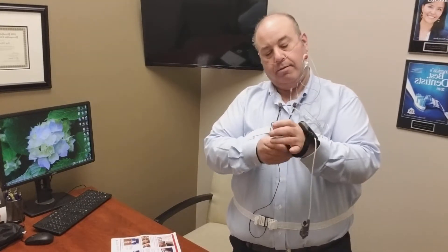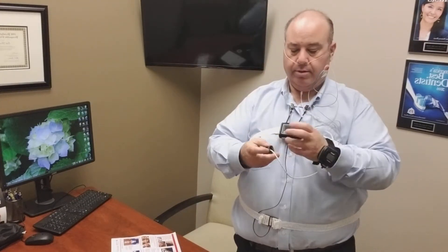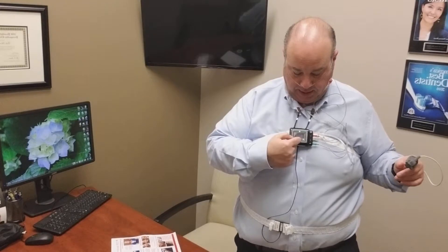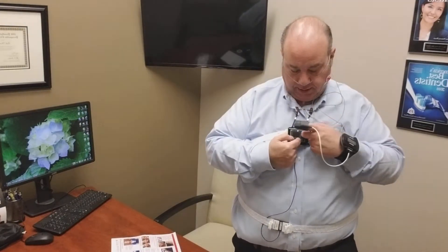Next, the pulse oximeter. This will go on your wrist, and you'll have it on your index or pointer finger — it will automatically start. From this point, you're all ready for bed. When you're ready to go to sleep, press the center button — the square one — push and hold it, and you'll see the line going across. Then go to sleep.